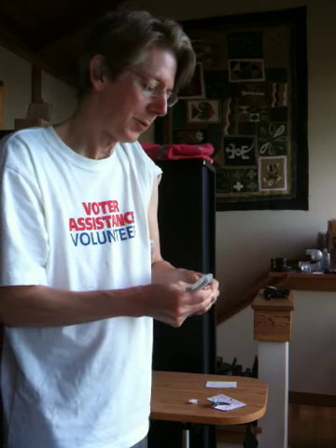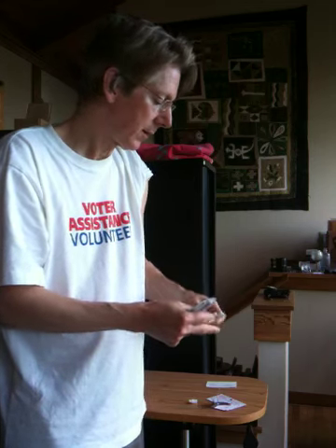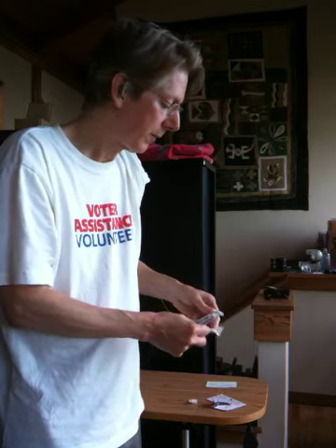I have to be very careful not to get this wet — I can't go swimming, I can't get it in the shower. But I have to wipe it off with alcohol before I do the flush.